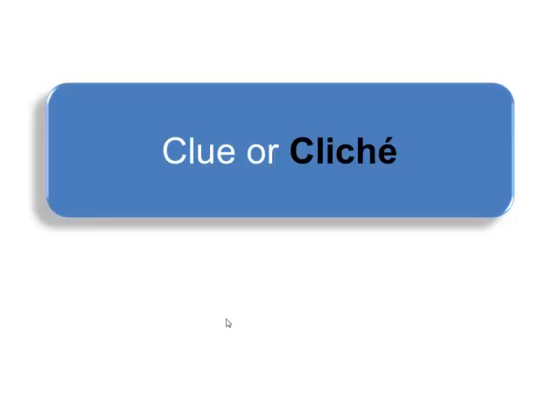Another clue or another cliché — what is this? We can see here blue clods and brown clods, or blue globules and brown globules if you prefer that term. You also see some white lines. Blue clods are a clue for basal cell carcinoma, and brown clods are a clue to a melanocytic lesion. But of course, brown clods or brown globules may also be seen in basal cell carcinoma.